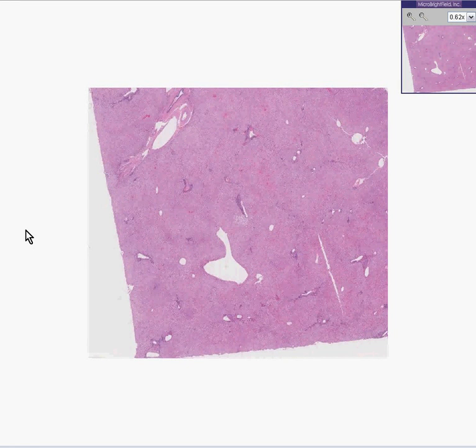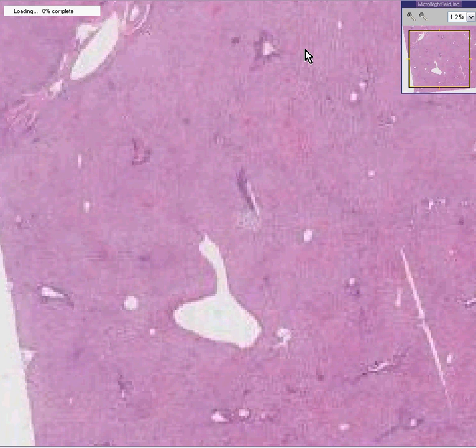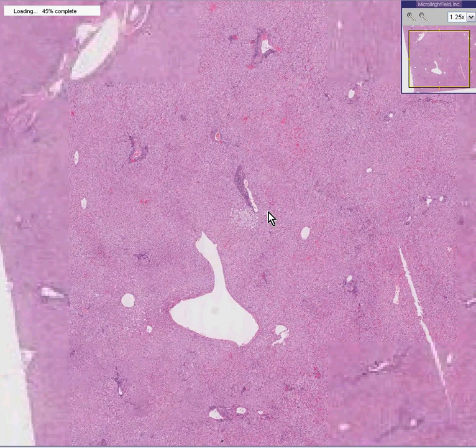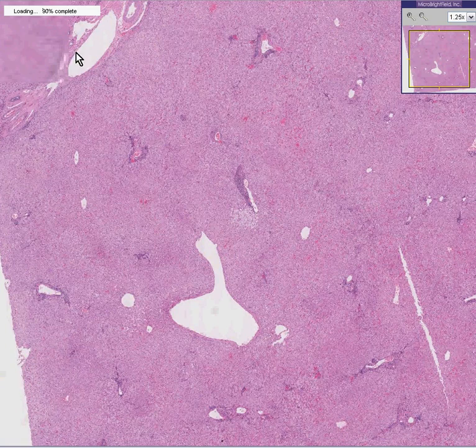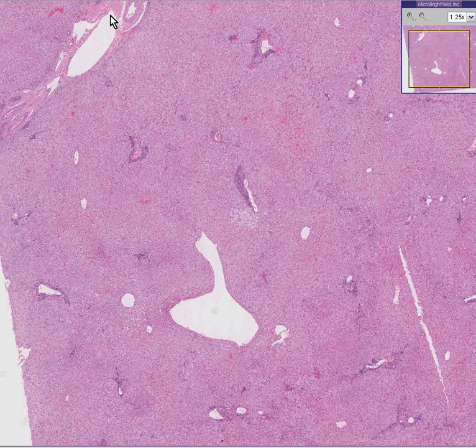When you look at a liver on low power, like we are here, it's really not much different from looking at that liver grossly. Because when you look at a liver grossly, you see liver, which is brown, and then you see little spaces between them, which are some type of blood vessel. If grossly or microscopically you can see that some of these vessels, which are all veins, have arteries with them and bile ducts, you know that's a portal area.